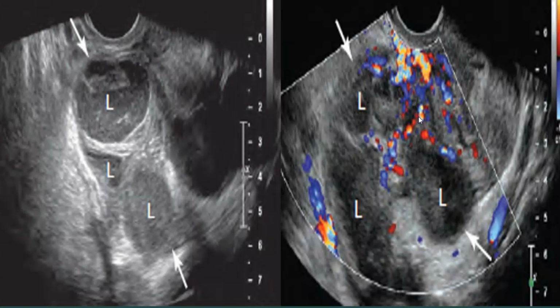And here you can see the blood flow is seen between the tissues, and no significant blood flow is seen within these loculations. So this is a Tubo-Ovarian Abscess, and this Tubo-Ovarian Abscess is due to pelvic inflammatory disease.